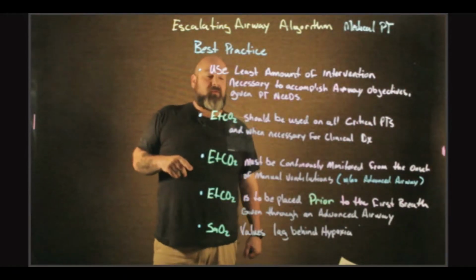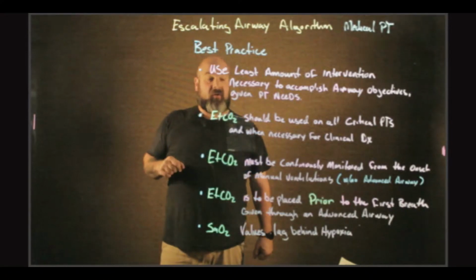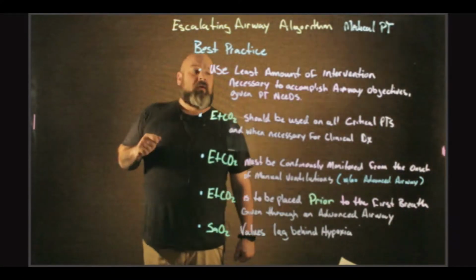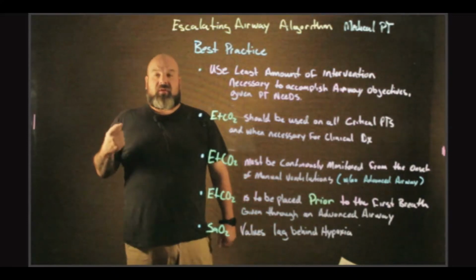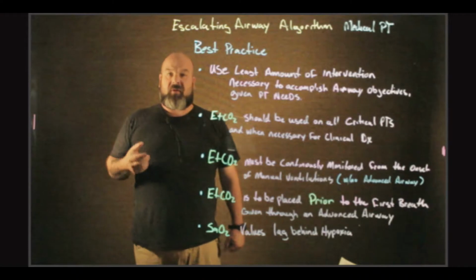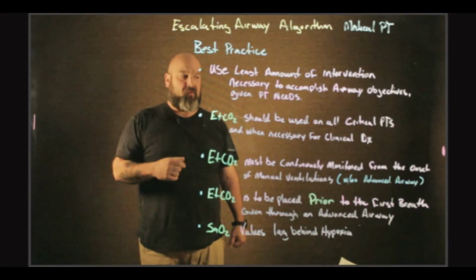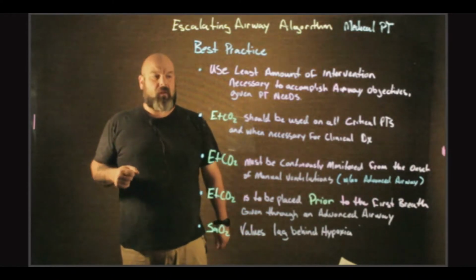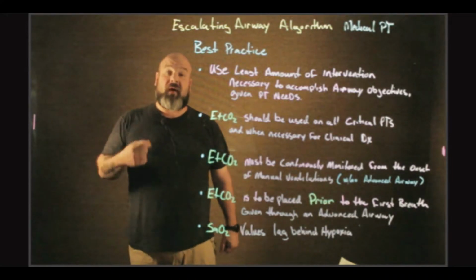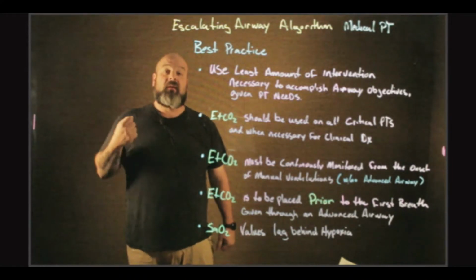End-tidal CO2 should be used on all critical patients and when it is necessary for a clinical diagnosis. So end-tidal CO2 is going to give you your best indicator of ventilatory status of your patient. It gives you a breath by breath, real-time indicator.